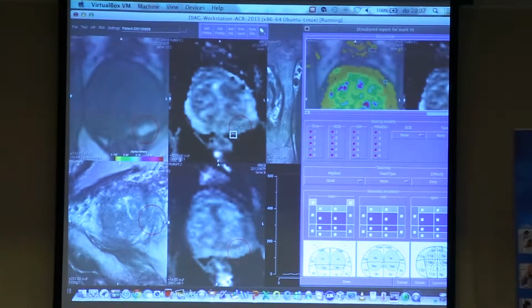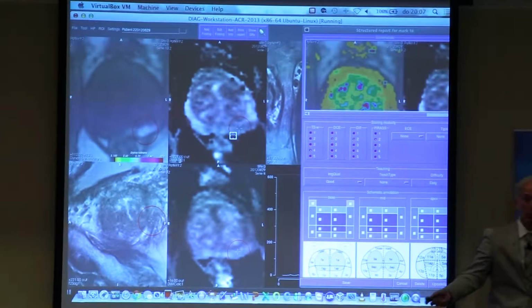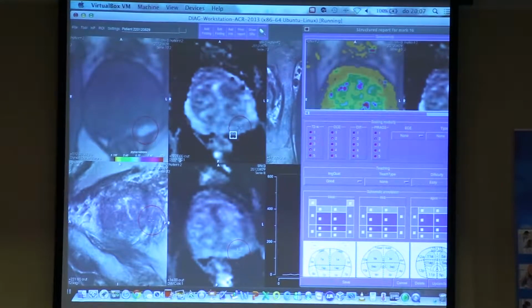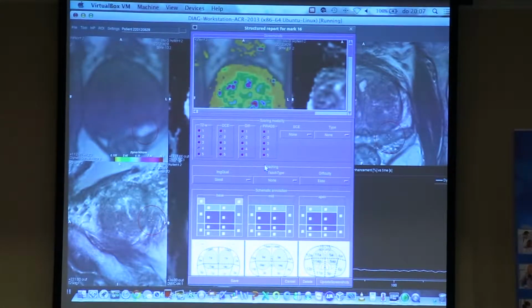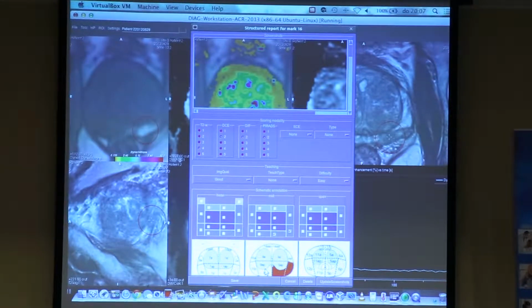Okay, now I will show you a thing which I did hide for you. What does it mean, a white spot? You see a white spot in a T1 weighted image. Hematoma. Okay, so this was blood after a biopsy. You can see that even with blood after biopsy, we have the right diagnosis. So this is no tumor. Okay, where is it located? It was located over here. Click, click. And we say save.